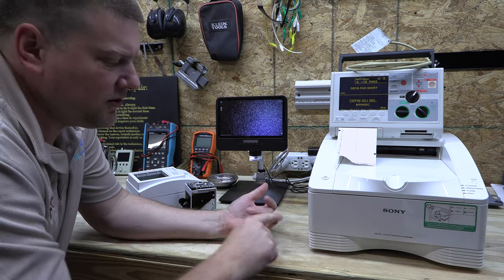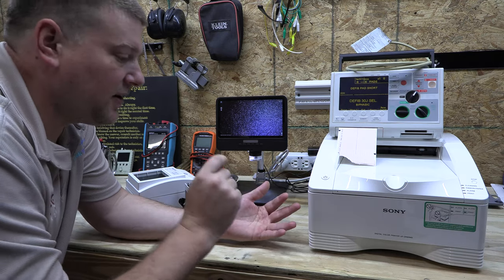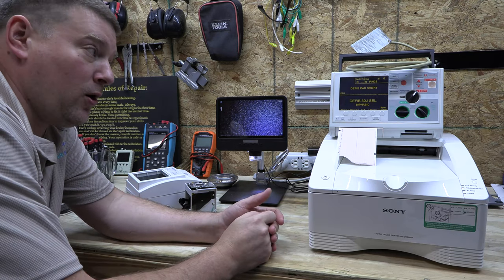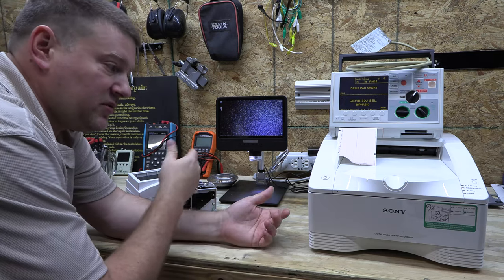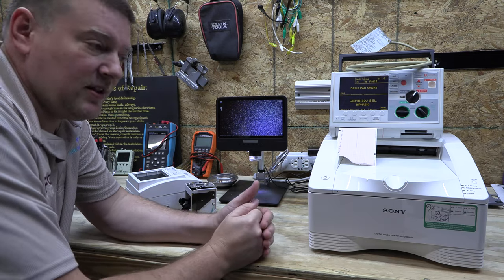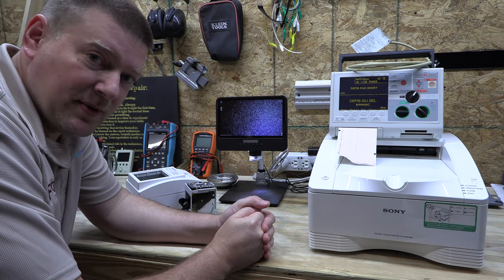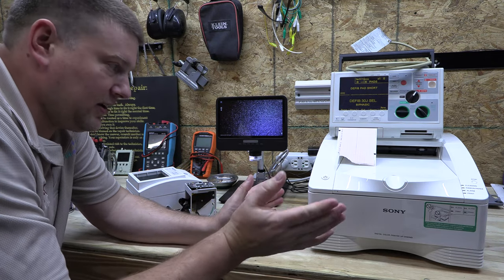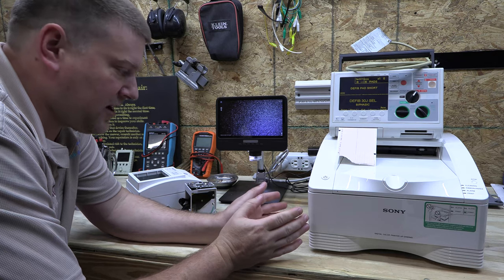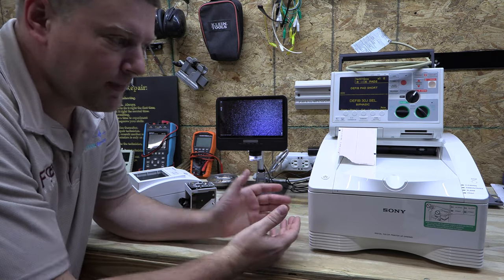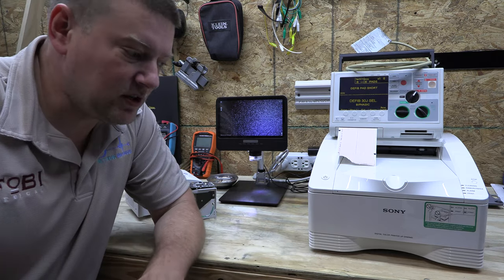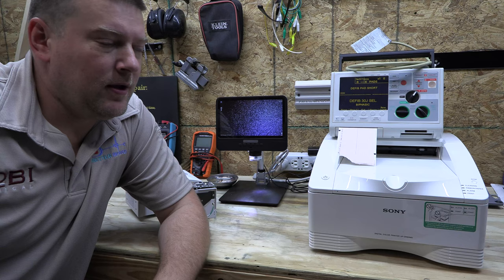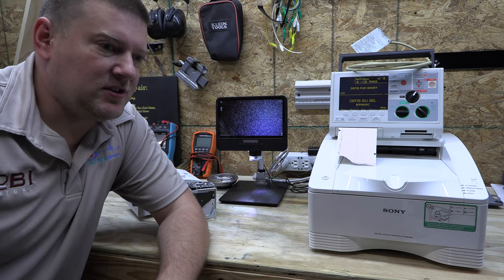It's important that you understand how these printers work, how the consumables work, how the user's responsibility is going to be definitely different than the biomed's responsibility. And we're going to go through every aspect of it that I can think of. Let's go ahead and start with printer technologies.